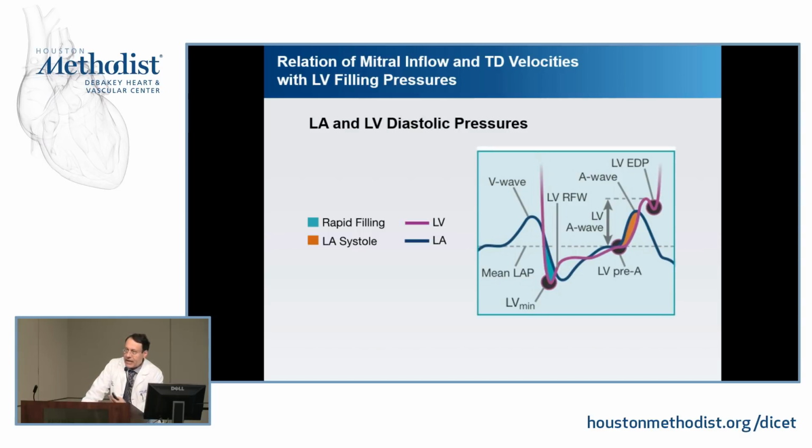Echocardiography and any modality that seeks to assess diastolic function would like, or ideally should be able to give you information about different pieces: relaxation, stiffness, in addition to pressures. But the part that is most reliable is the pressures piece. Though in some situations saying that the ventricle has abnormal relaxation is straightforward, for example in a heart with depressed ejection fraction. So what are the pressures that can be measured in the ventricle?